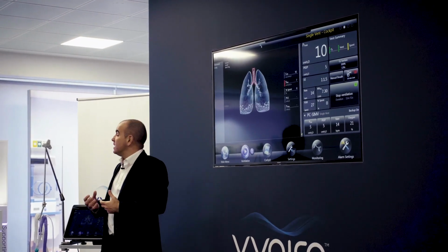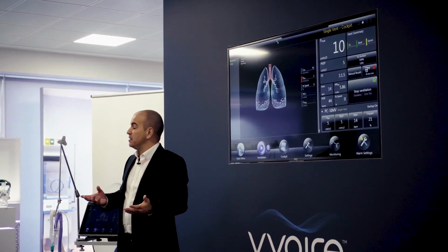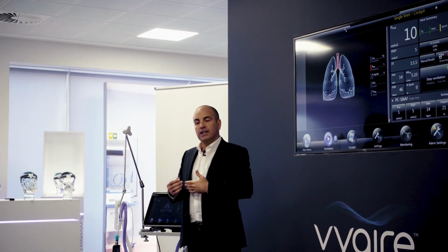My background is nursing, and typically you would get a phone call at maybe 6 in the morning and say, how's the patient in bed 5? If all is well, maybe turn the sedation off, and then the clinician will come in later and reassess them.